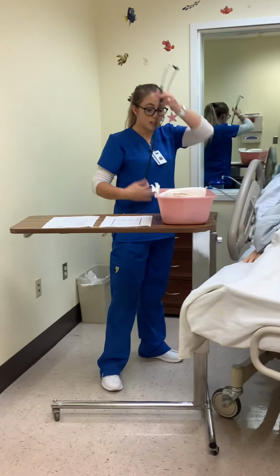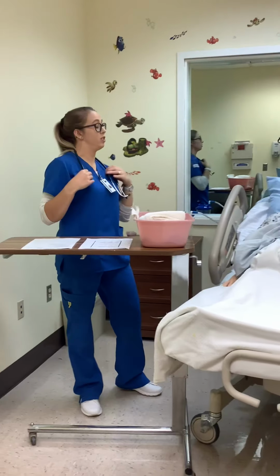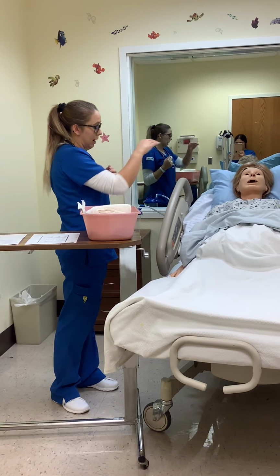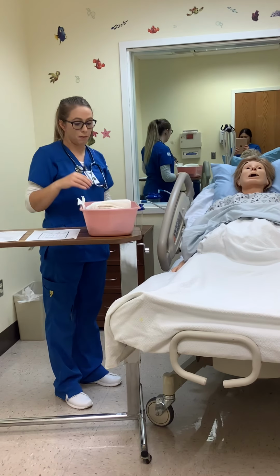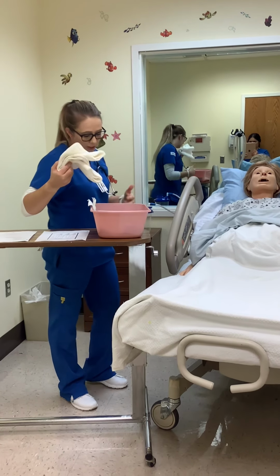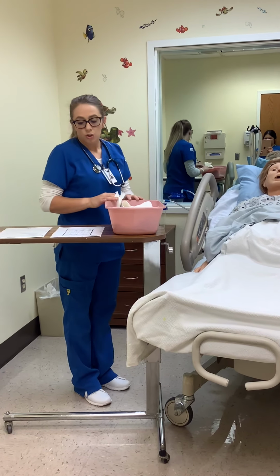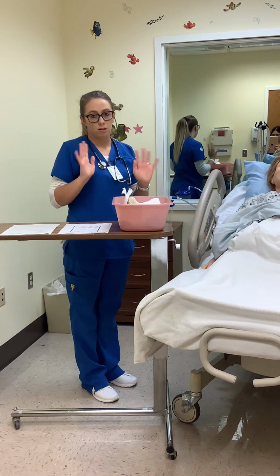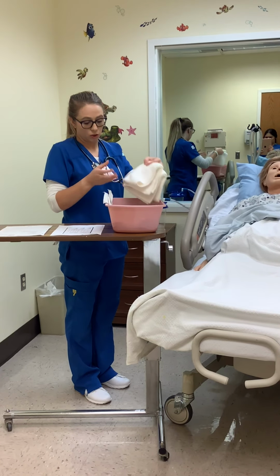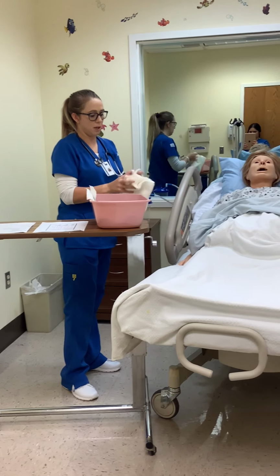Okay, Shirley. So today the doctor would like me to put in an NGT tube, which is a nasogastric tube. It will go through your nose and kind of down your throat. This will relieve some of that bloating and kind of fullness that you're having. Hopefully it will help with your pain. So first, again, hand hygiene. I am then going to pull out the towel here to lay it across the patient's chest.